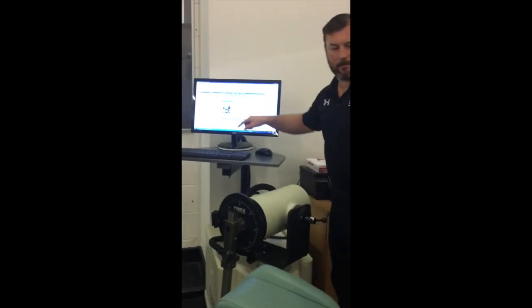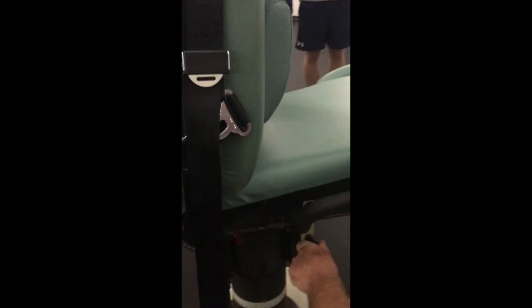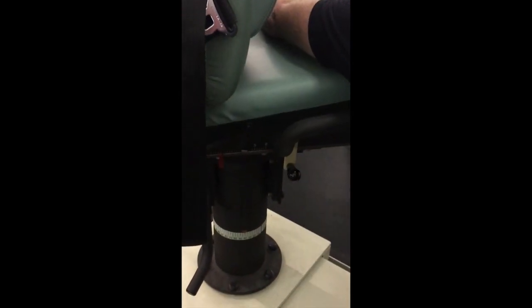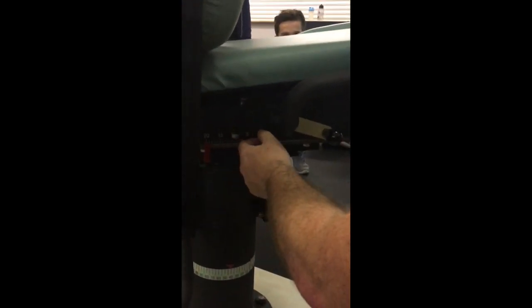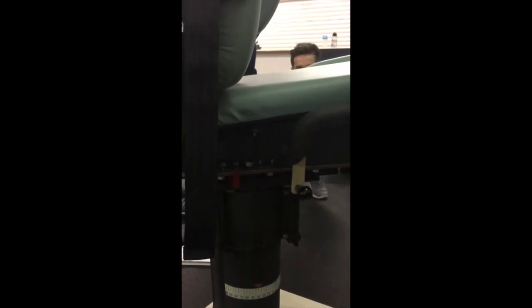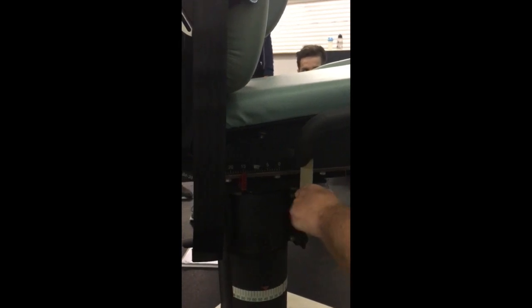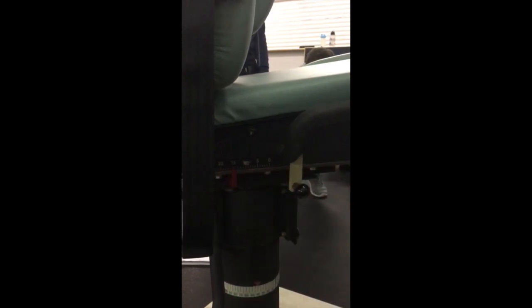Fore and aft position is one down here on the side, so I know myself if you want to come around here. Yeah. There's a lever here, again there should be a lever there, and there should be a load of numbers. You can flick that one, what does it say on the screen, fore and aft? 15. So you just move it to where the red bit says 15 and lock it again. So it's literally just unlock it there, and then there's like a ruler here with the numbers on, set it to 15, lock it. Okay? And what's that one called? That's fore and aft.